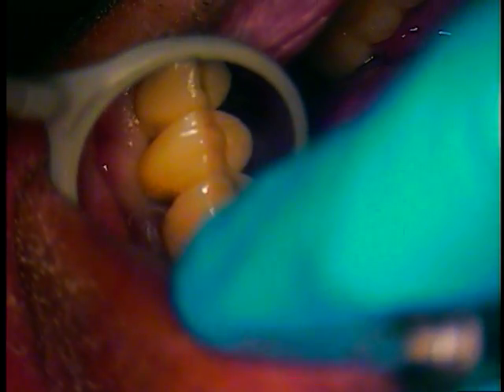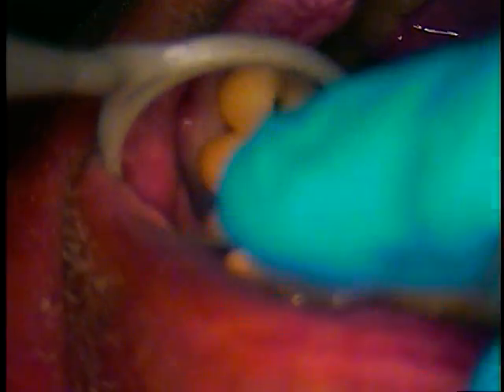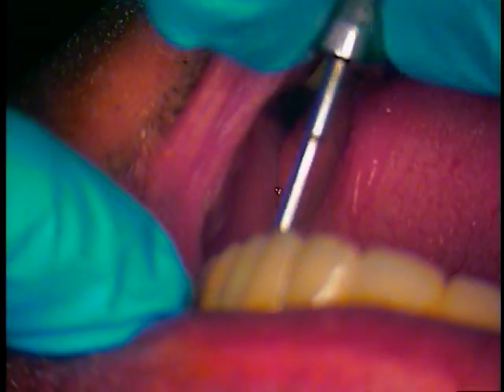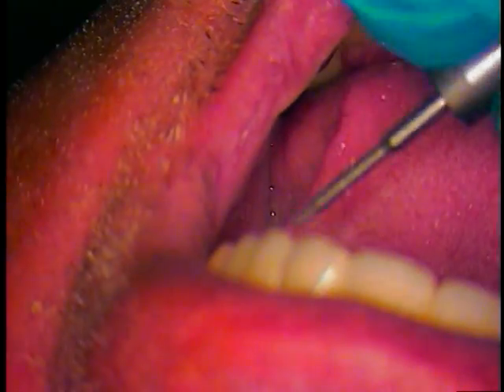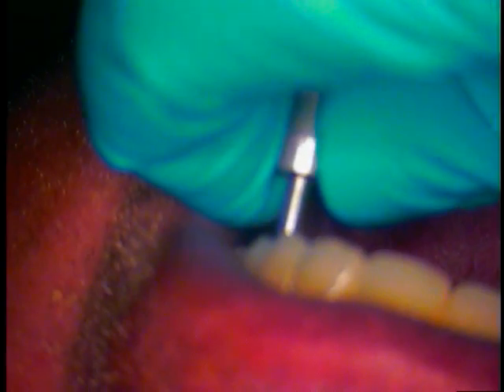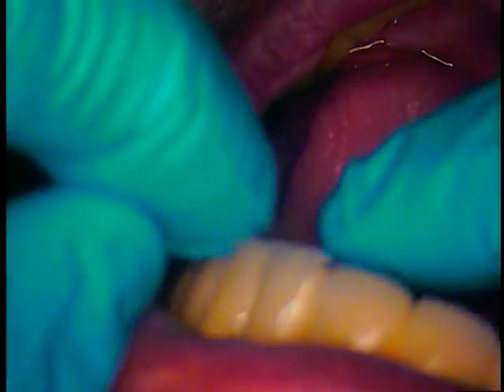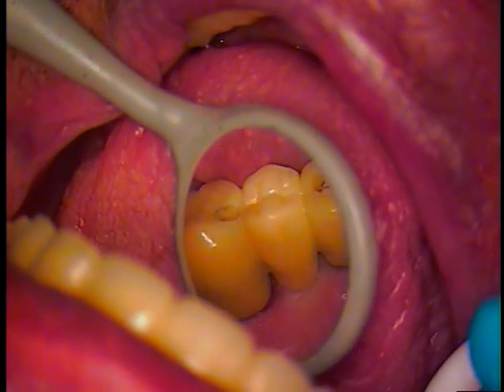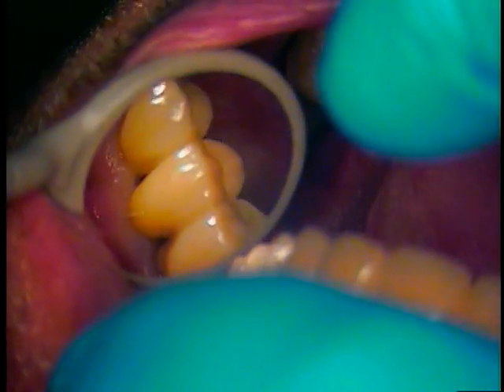You're going to see some tissue blanching, so we're going to keep going where the pontic is. Check the floss again. Hand tightening now. Floss again. Perfect.